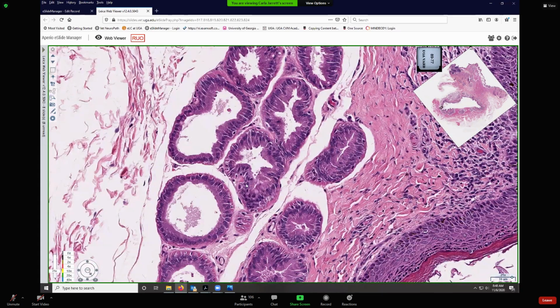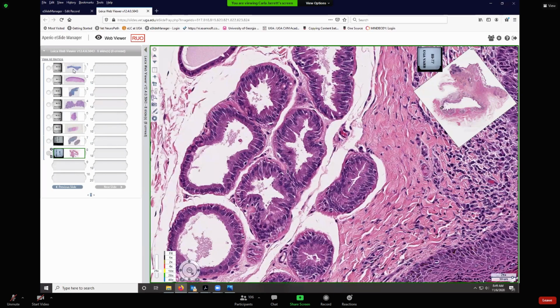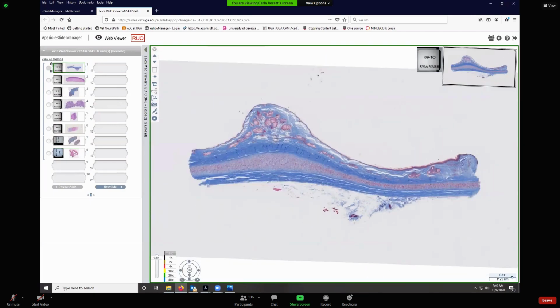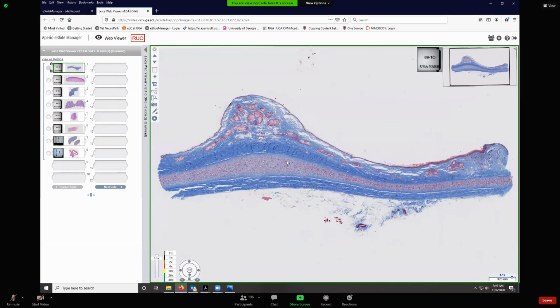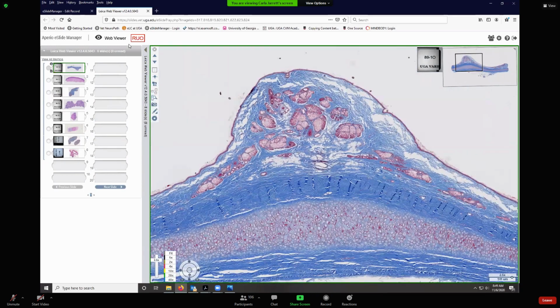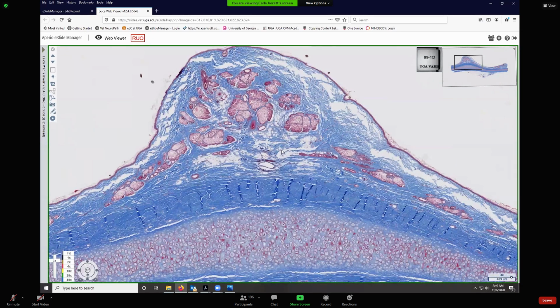Okay, those are the glands of the anal sac. And that's easy to remember because they just surround the anal sacs. Okay, we'll come back to that slide for a couple of other glands. The next on your list is the pinna of the ear. And it's all going to go faster now because we already know what sweat glands and sebaceous glands look like. So we just have a few things to touch on and we'll finish up.